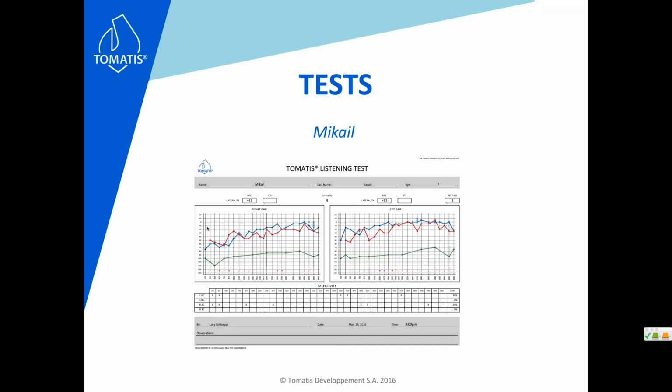Okay, so I thought in all three zones both sides were off. Let's see, the gaps were also more than 10 dB in certain areas. So there are some touches and overlaps, and then also some big gaps. That's why there's a big disharmony in the curves.